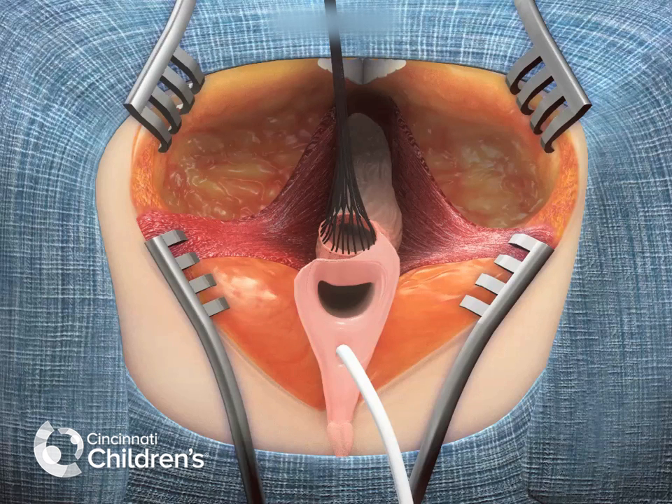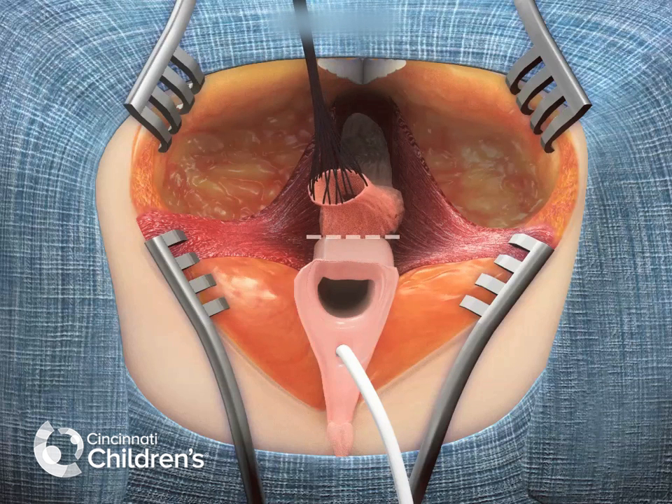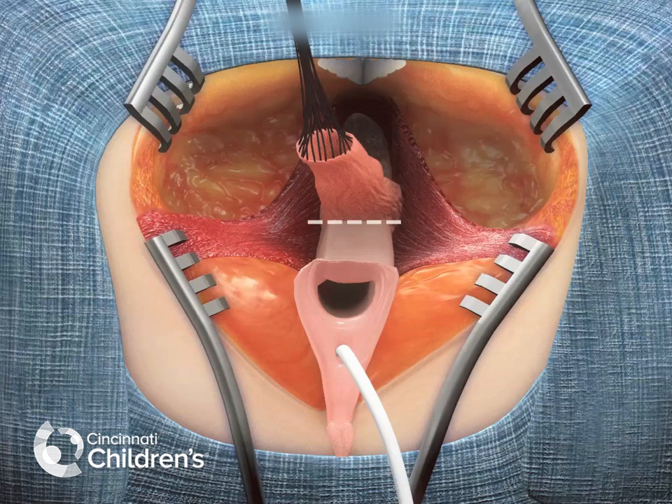The first part of the operation involves dissecting the rectum from the posterior wall of the urogenital sinus, as seen here. Traction stitches on the edge of the rectum are used to create a plane between the posterior wall of the vagina and the anterior wall of the rectum until the rectum is completely freed.